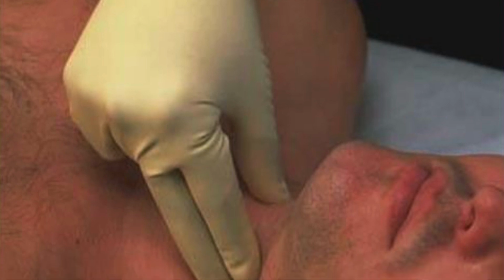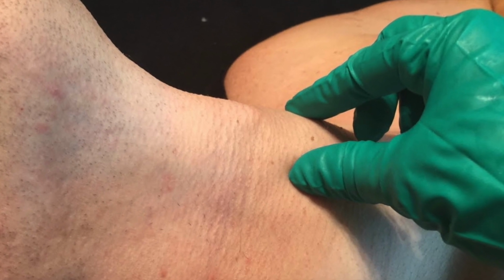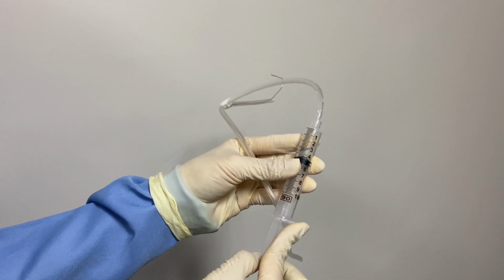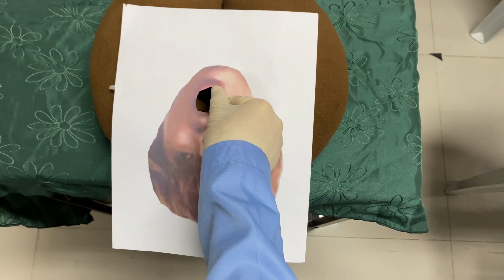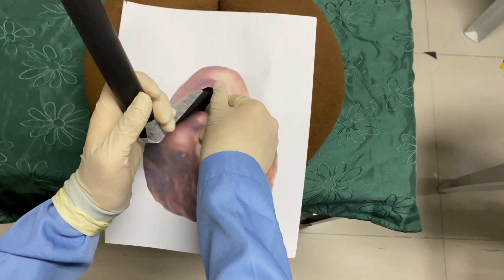If the patient's time of previous ingestion is not known, perform Sellick's maneuver in order to prevent aspiration of gastric contents. Make sure to check the patency of the cuff by inflating the pilot balloon. Deflate once confirmed. Position the thumb and the index finger of the gloved right hand on the right mandibular and maxillary premolars. Fully open the mouth with scissored motion.